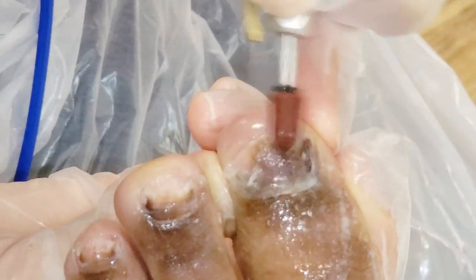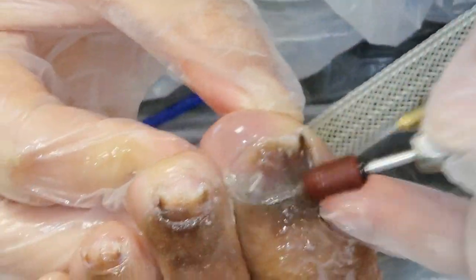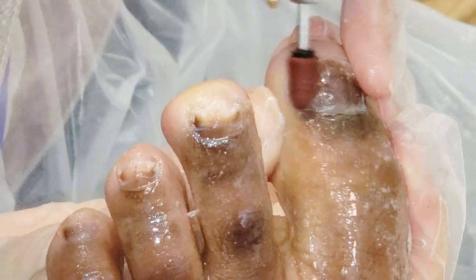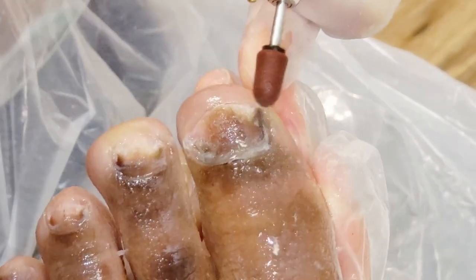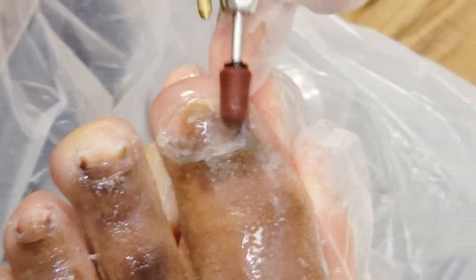It's really attached. That one's really lifted, so you can actually follow it down. I'll probably need to cut this. To really clean this off, you cannot really have nail surgery because it's going to start being really uncomfortable once I get down to the base, so there's a very limited amount of removal I can do with the drill.